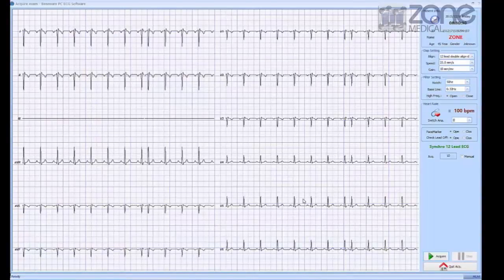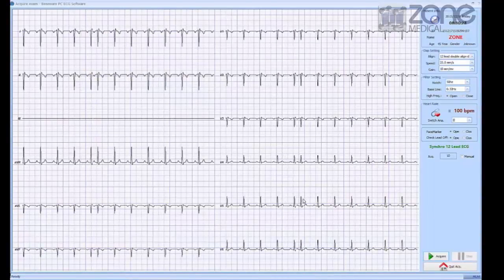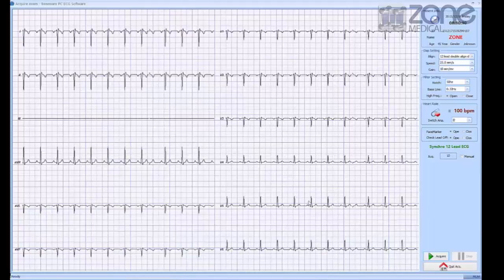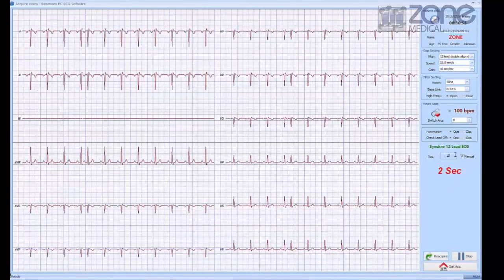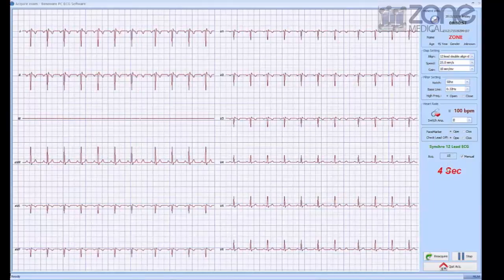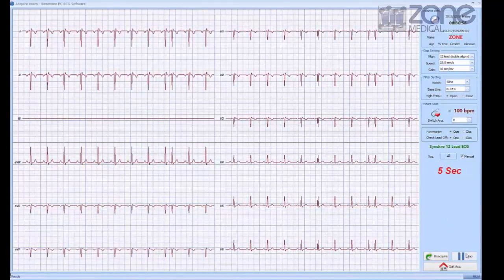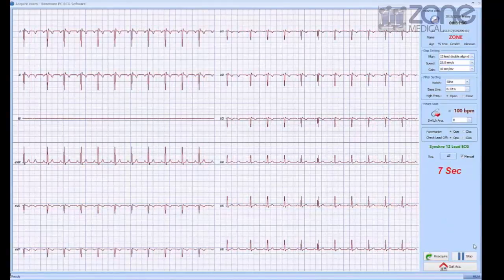Now you have a real-time observation of your ECG screening. If you wish to begin recording, press the acquire button. You can also change the amount of time it's recording by clicking manual.